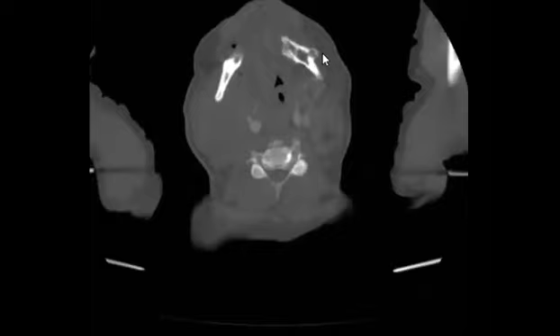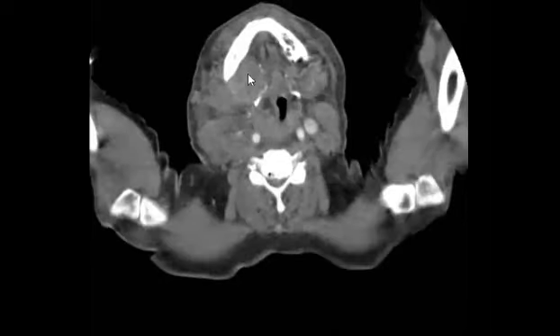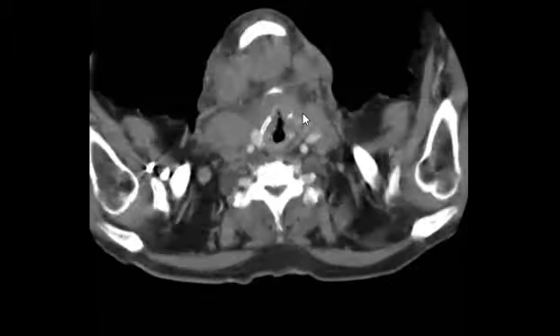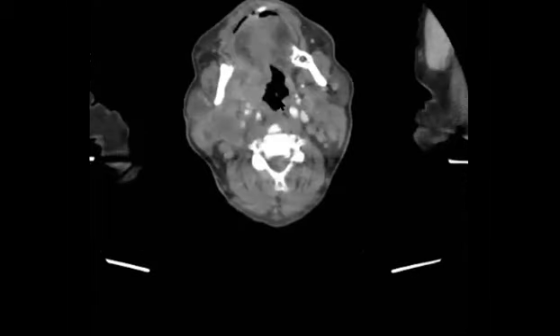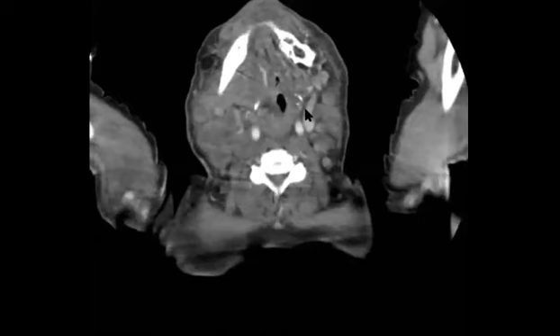It can be osteomyelitis. But this patient already has many masses. And the most important thing when you go to oropharyngeal and laryngeal tumors is that they present with lymphadenopathy much more than the primary tumor itself. Yes, it can be metastatic.